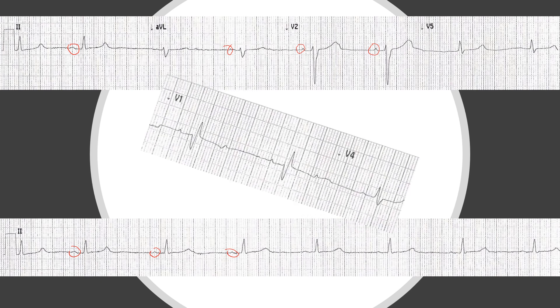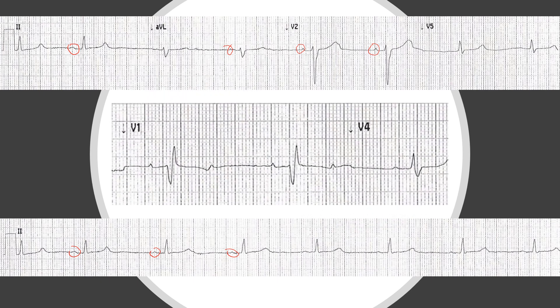But if we look at lead V1, we notice it is not just one P wave — there is what looks like another one before each complex. If you map this out, you'll find that they map perfectly, which means this is actually not first degree heart block. This is a second degree heart block, which will completely change your management plan.